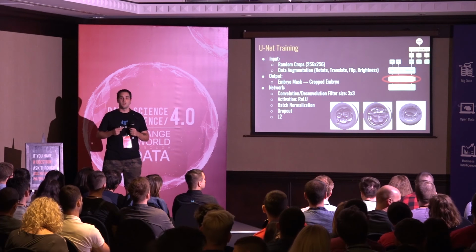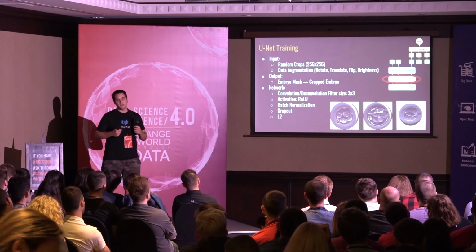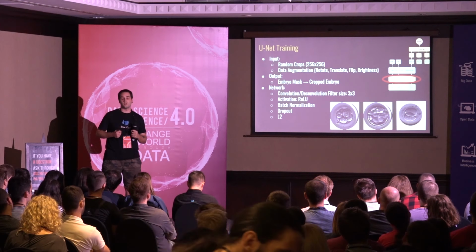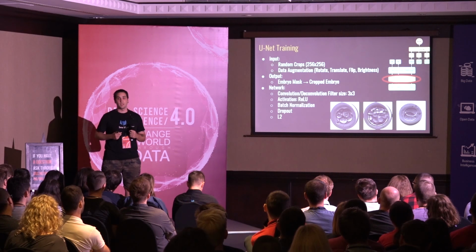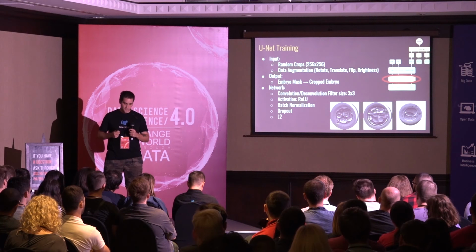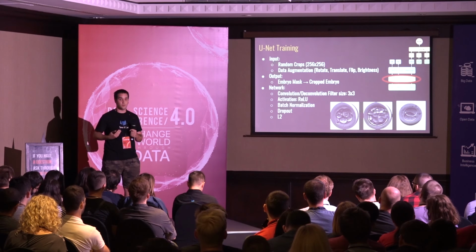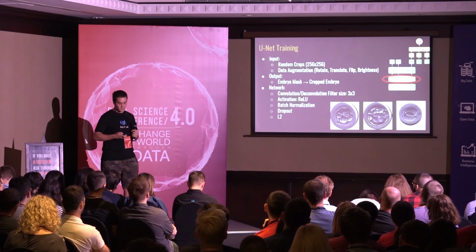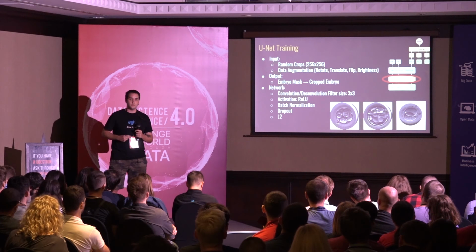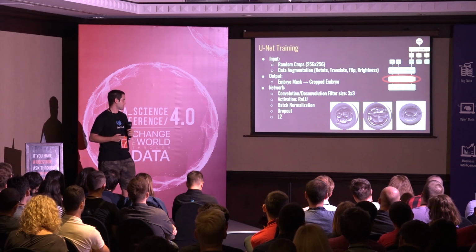Then we did some data augmentation, like random rotation, translation, vertical flip, horizontal flip, adding some noise, etc. As long as we apply the same augmentation on the labels, the binary mask, we were good. And the results are much greater, almost perfect, and much better than OpenCV.